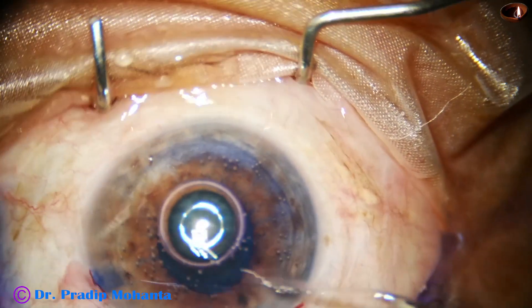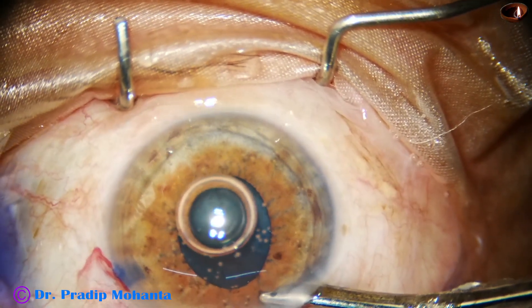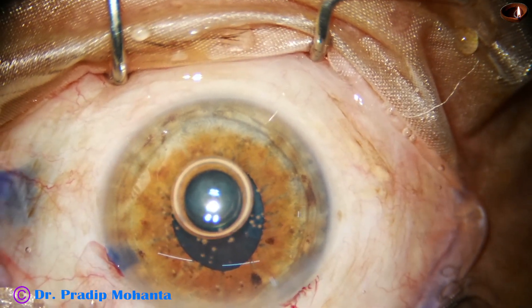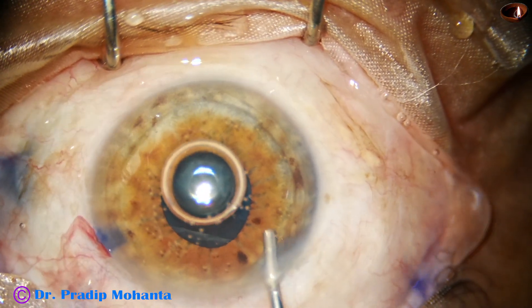This is a bit of phenocaine and it did not have any effect on the size of the pupil. Phenocaine is a combination of tropicamide, phenylephrine, and lignocaine.